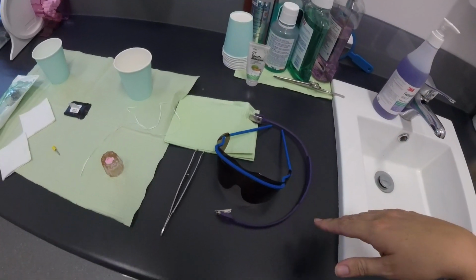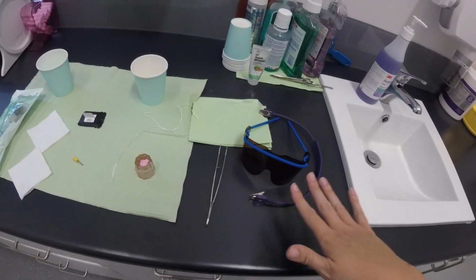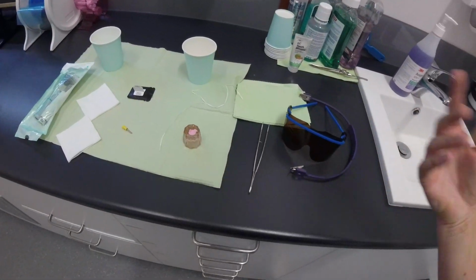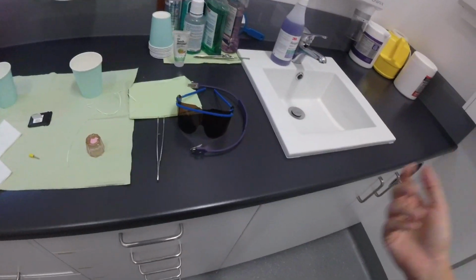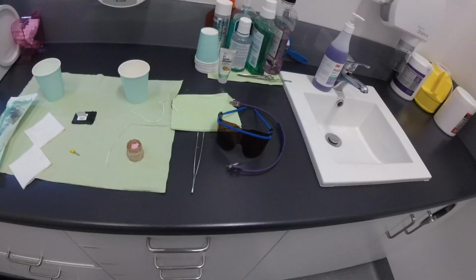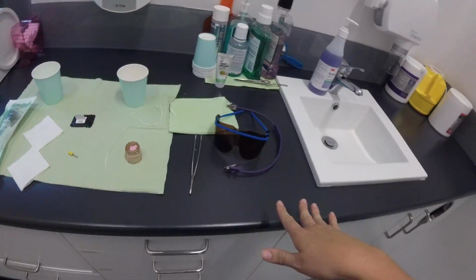So when the patient comes in, you get them seated into the chair, you just say, here, I'll just pop it. I never say bib, actually. I say a drape in front of the patient. I'm going to put a drape on you. I just think telling your patient I'm putting a bib on you suggests something else. So it really doesn't matter. So I just say, here, I'll just put a drape on you.